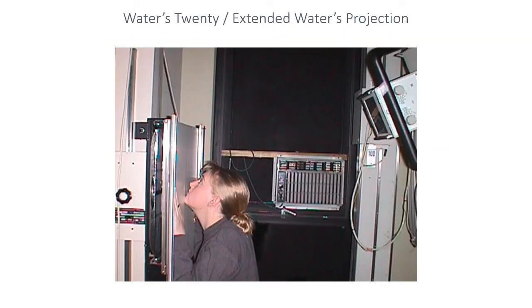You can see in this photograph that the patient is once again in an identical position, and in this situation we would once again be saying to the patient we're going to be taking 2 or maybe 3 projections. Try to stay in that position while we continue to perform these projections, and I'll get you to relax at the end of the series.